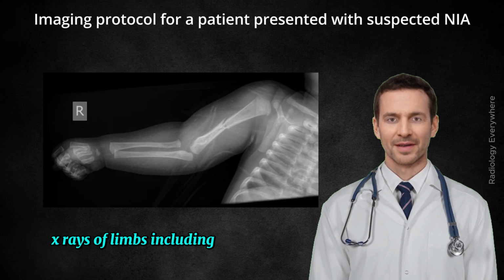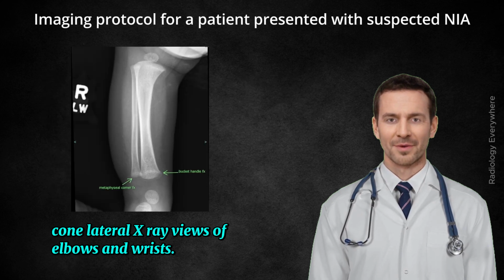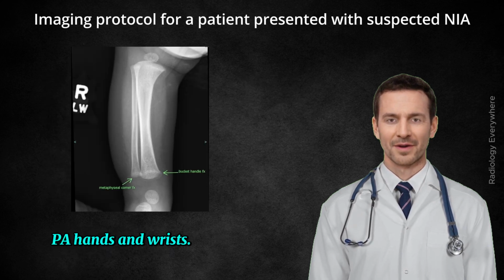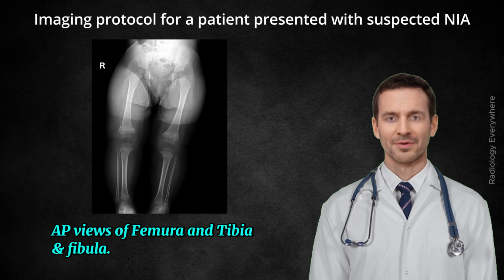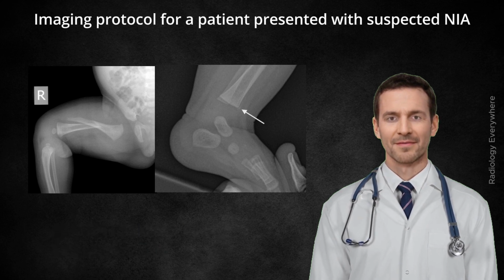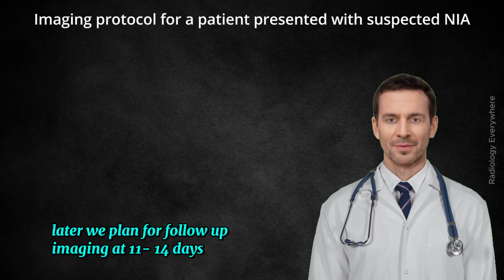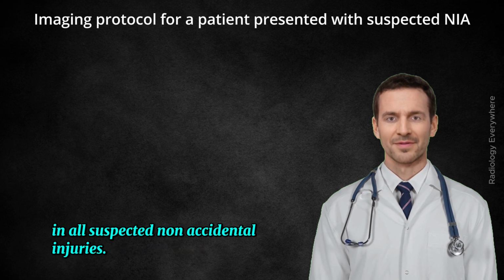X-rays of limbs including AP humeri and forearms. Coned lateral X-ray views of elbows and wrists. PA hands and wrists. AP views of femora and tibia fibula. Coned lateral X-ray views of knees and ankles. Dorsoplantar view of feet.